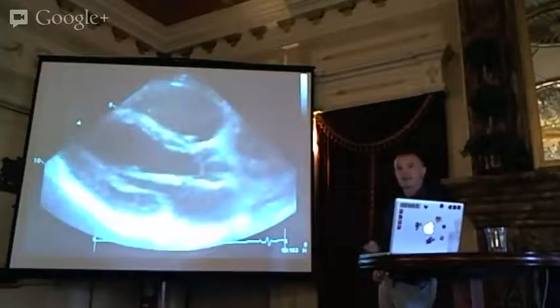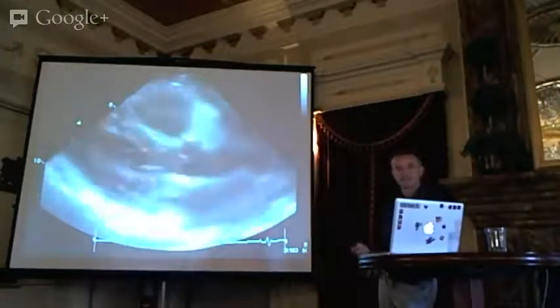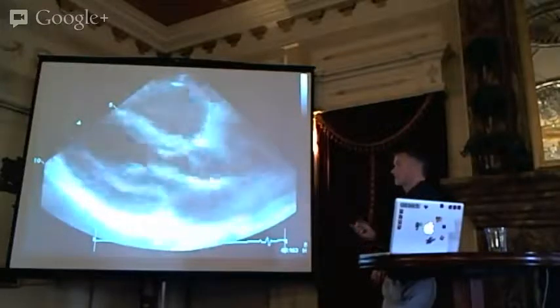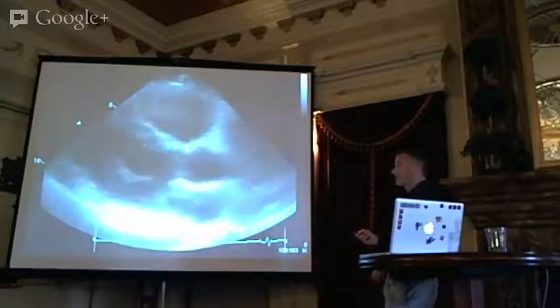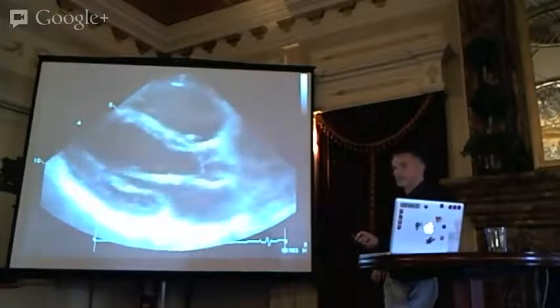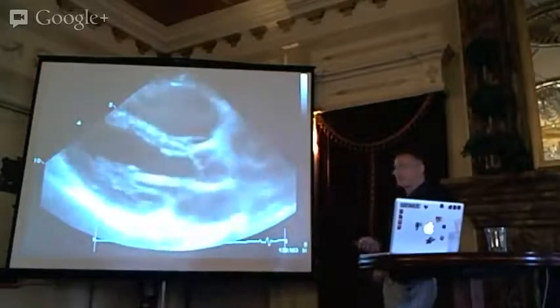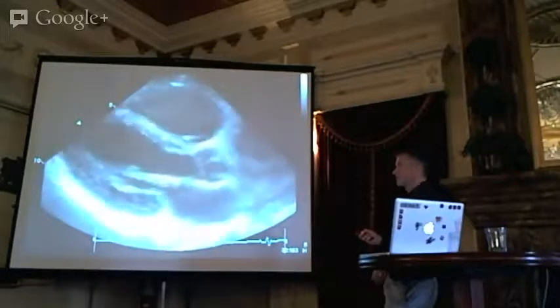So I do a basic echo, a bit like a FAST scan, and it's a yes or no question. So the FAST scan, is there fluid, isn't there? The basic echo, I say, is there fluid around the heart? I'll start up here, I'll kind of go down like that, counterclockwise. So is there fluid around the heart? No. Then I want to look at the RV, the right ventricular outflow tract. Does it look bigger than the left ventricle? Is it pushing down and flattening that septum? What would that be a feature of, potentially? Massive PE or anything that could cause poor coronary flow. Raised right side pressures. So is the RV bigger than the LV, pushing down the septum?